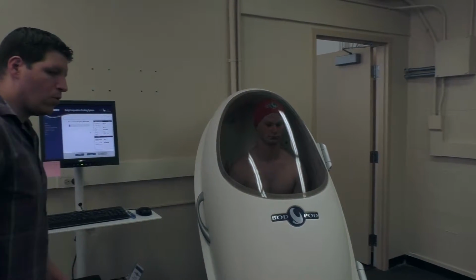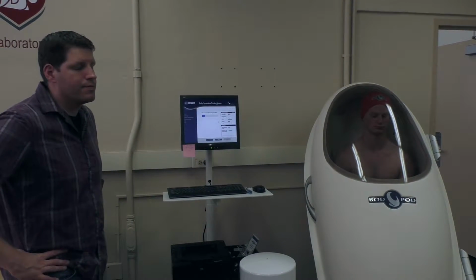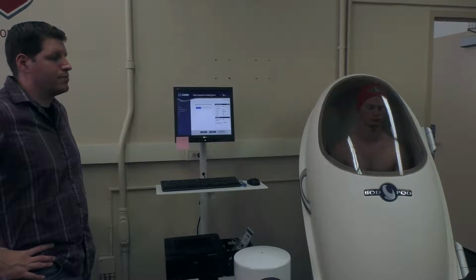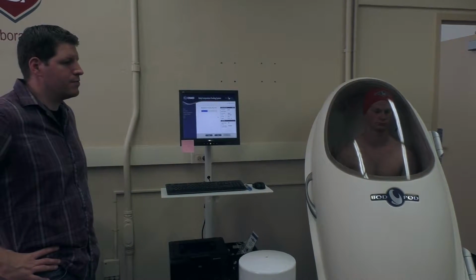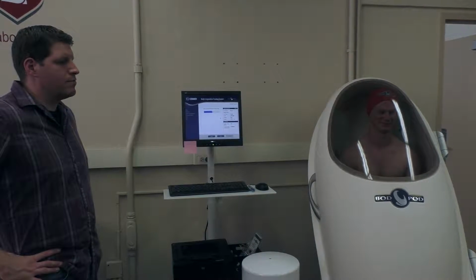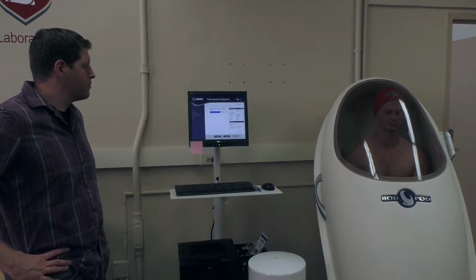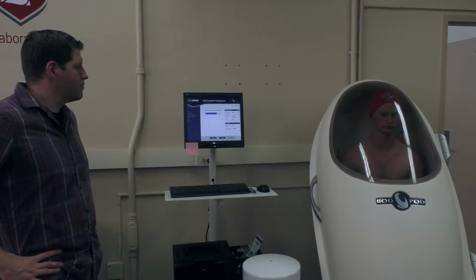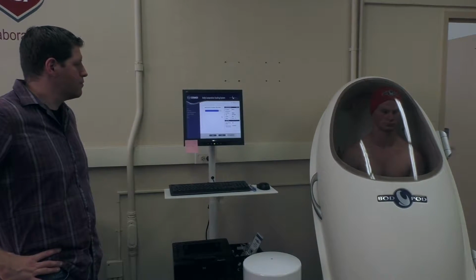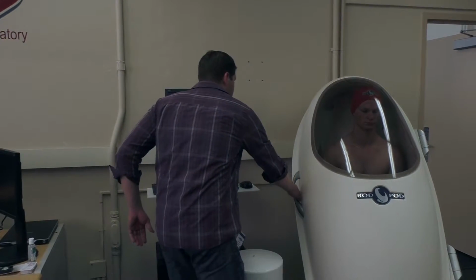And as I mentioned, there will be 2 separate tests. Okay, so the first one is done.